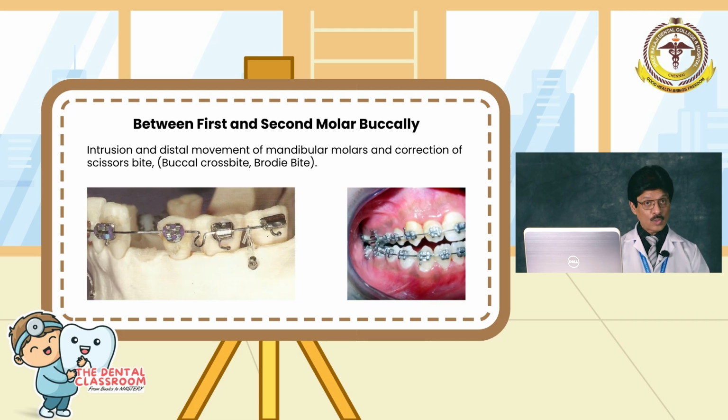The microimplant can also be placed between the first and the second molars buccally. Why so? For effective intrusion and distal movement of the mandibular molars and correction of scissors bite, like the buccal crossbite and the Brodie bite.